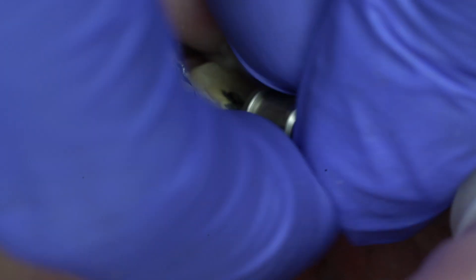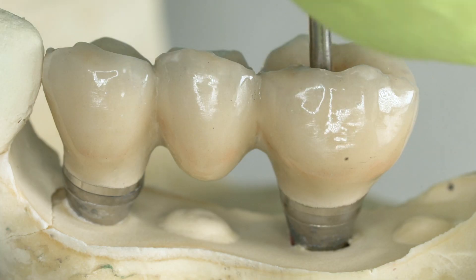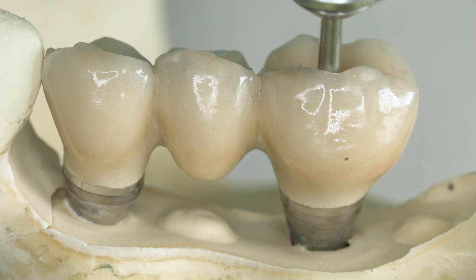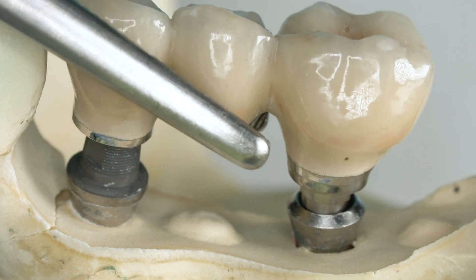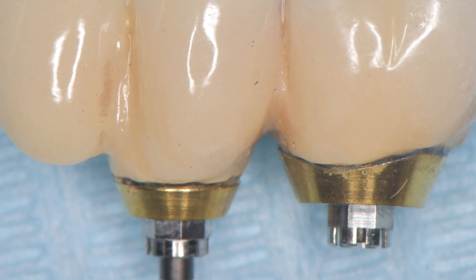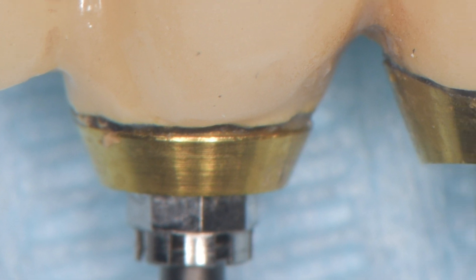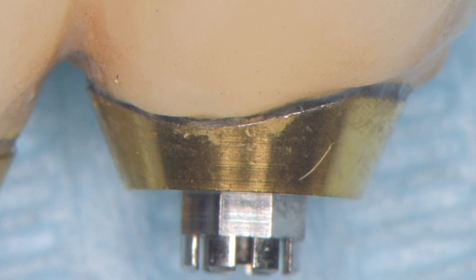When all the screws are completely unscrewed, it is not difficult to remove the crowns. This fact prompted us to approach intra-oral cementing of screw fixation from the level of the implant, which we'll discuss in another video. As a rule, with cement fixation type, a gap is found between the abutment and the crown, which indicates the need to pay more attention to the accuracy of the work.